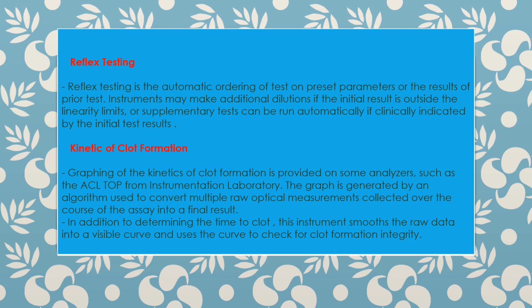Kinetics of clot formation. Graphing of the kinetics of clot formation is provided on some analyzers, such as the ACL-TOP from Instrumentation Laboratory.